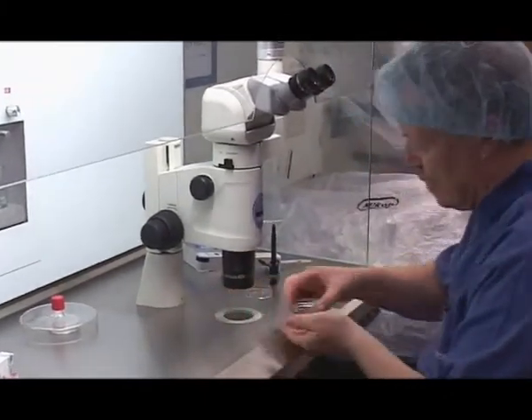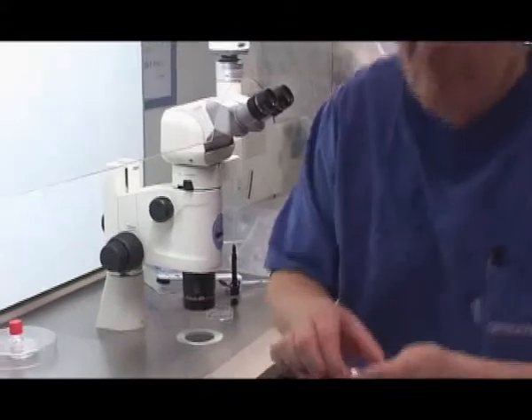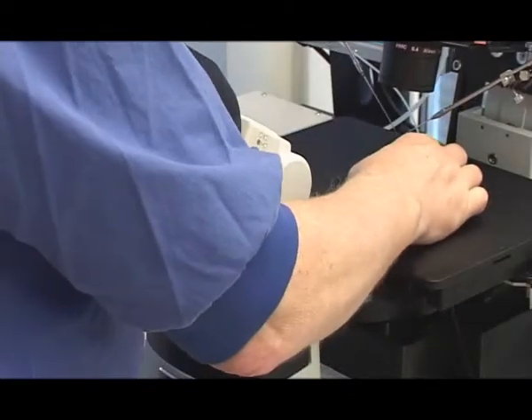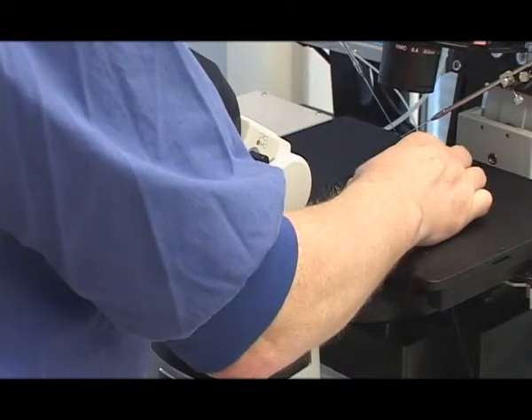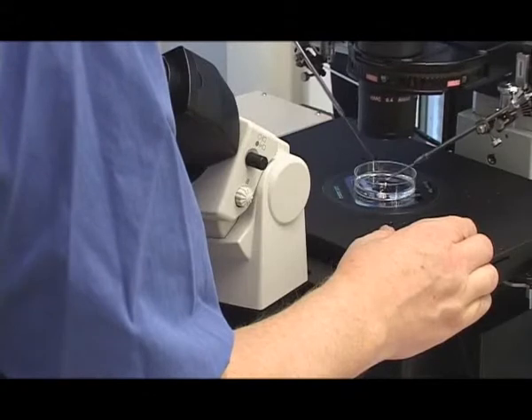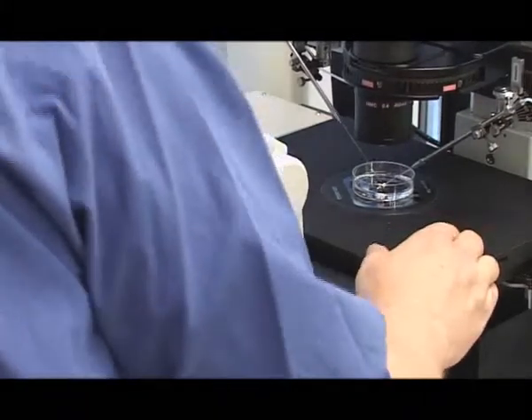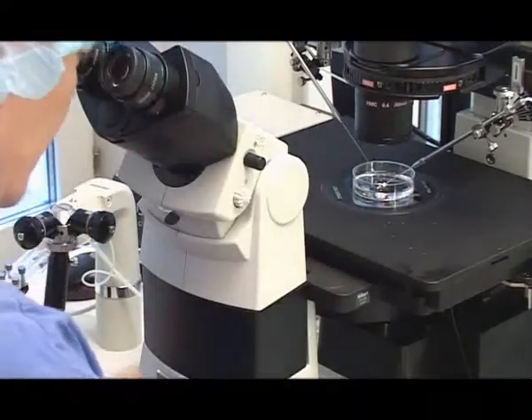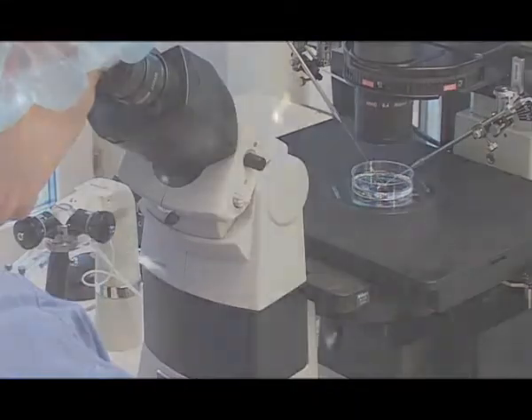Carefully transfer the prepared ICSI dish to the inverted microscope. Note the vigorous motility of sperm in the sperm suspension.